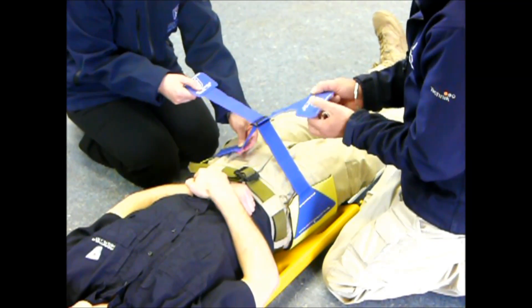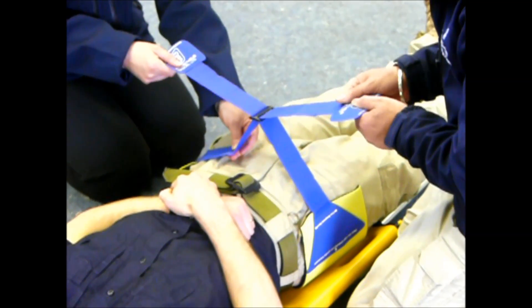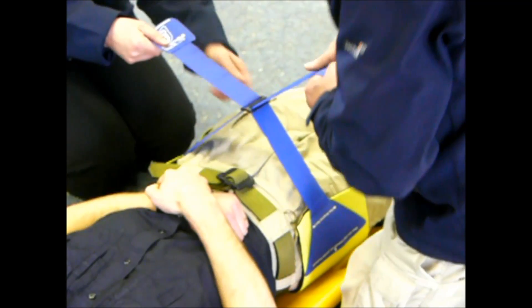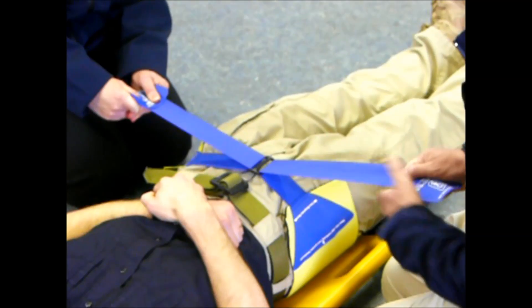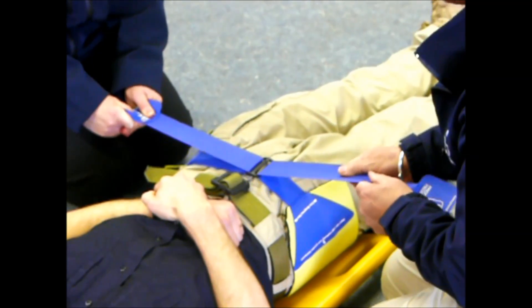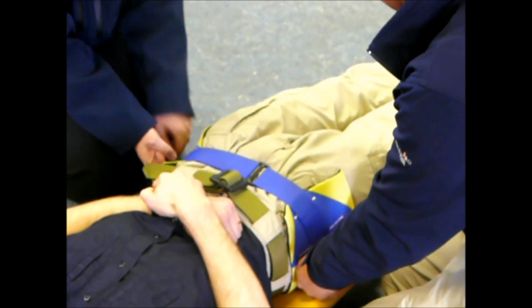Now we can pull these two square straps, making sure the buckle stays centrally over the patient. We can now apply circumferential pressure and apply tension to the belt. We can apply sufficient tension so that we can stabilise the fracture ends and help preserve the clot.